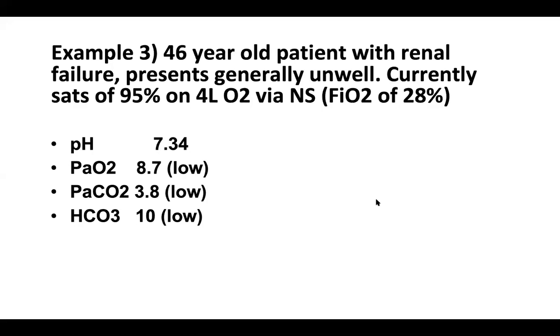Yeah, exactly. PaO2, I said above 8 is compatible with life, basically, but it's still quite low. And then a PaCO2 is 3.8, so that's low, and the bicarbonate is 10.